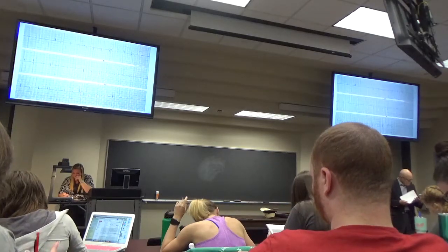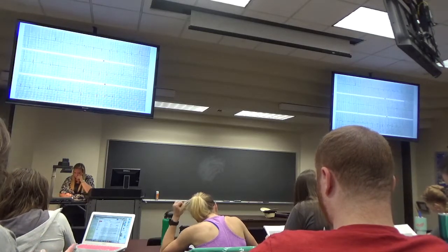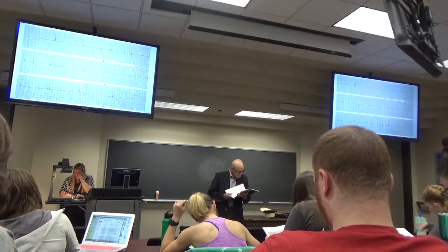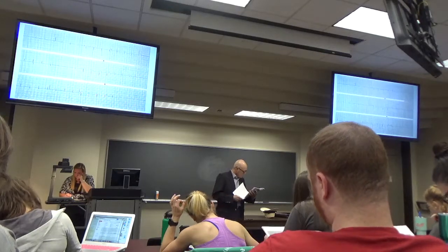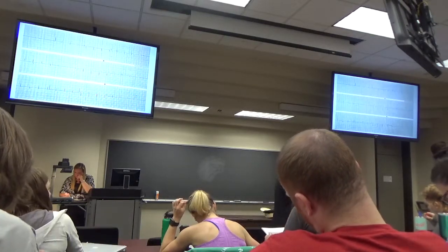And then I saw inverted T waves in leads V1 through V5. I call that anteroseptal ischemia. And I saw right atrial enlargement because of the peaked P waves in 2, 3 and AVF. You mean the tall P waves? P waves, yes, sorry.